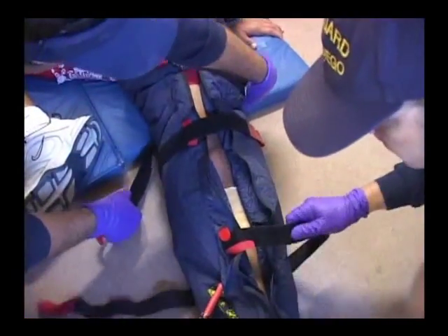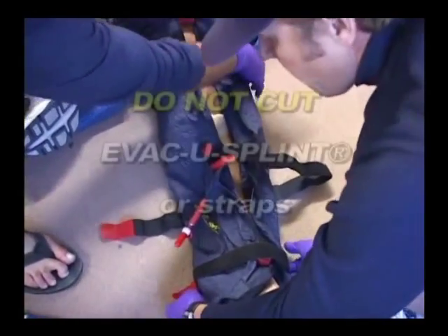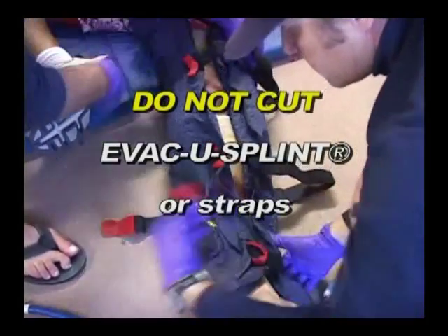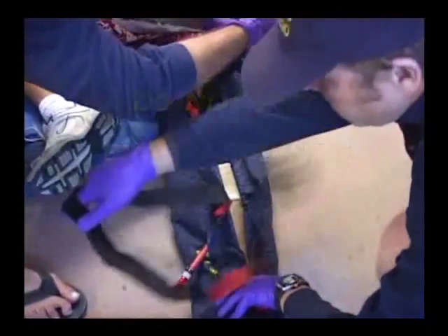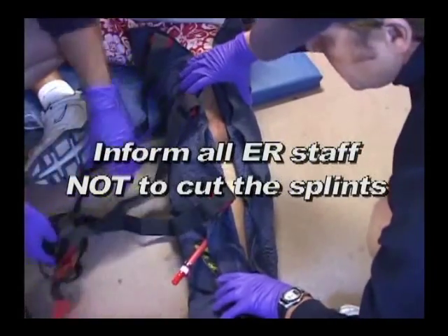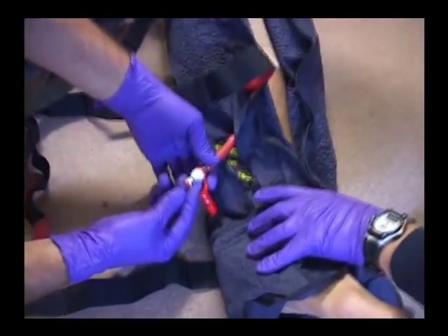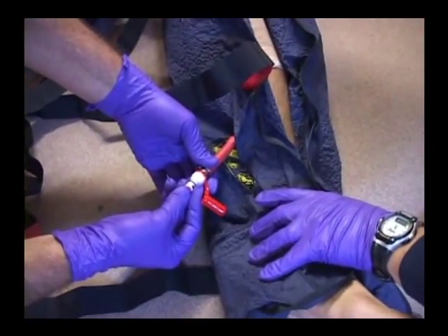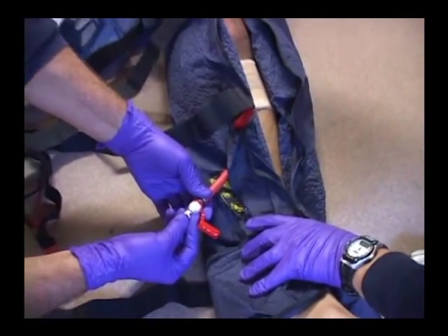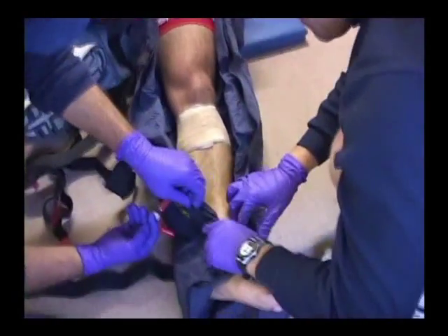Unfasten the attached straps prior to allowing air back into the evacu-splint. Do not cut the evacu-splint or straps. Please make sure all hospital personnel are informed about these removal procedures. Remove the red leash cap from the maxivalve, and while holding the maxivalve, depress the red plastic center section, allowing air to enter the splint. The evacu-splint can now be easily removed.